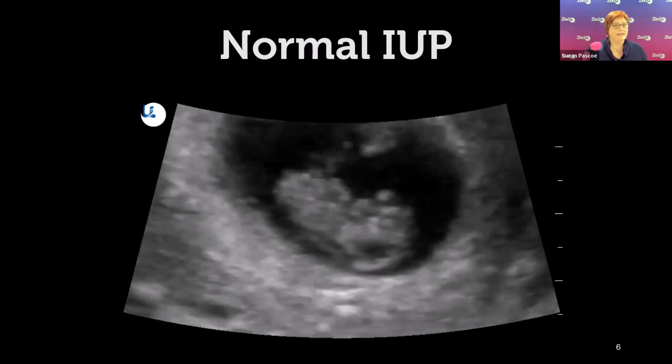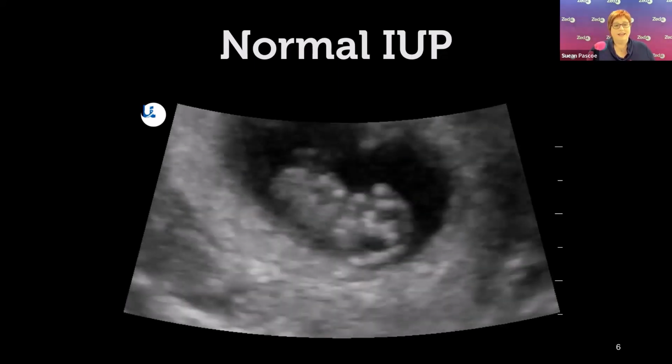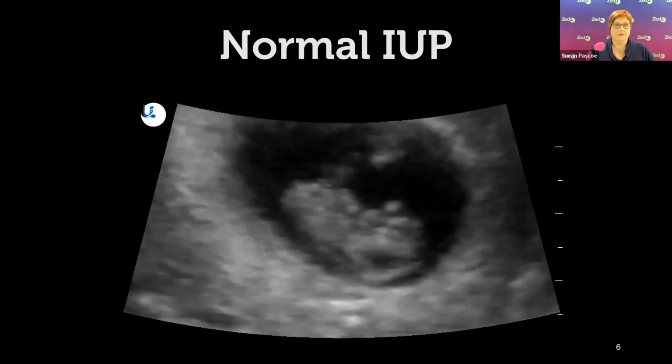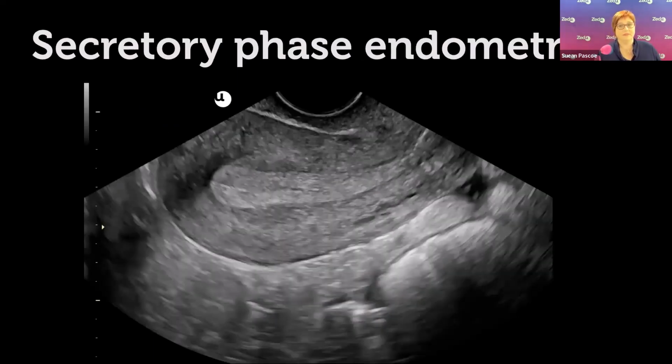And we are not going to see any signs of an intrauterine pregnancy at this stage. So a positive pregnancy test doesn't mean that we're going to definitively see it, but our patients' expectations are that they're pregnant and they want an answer. So let's start at the beginning.